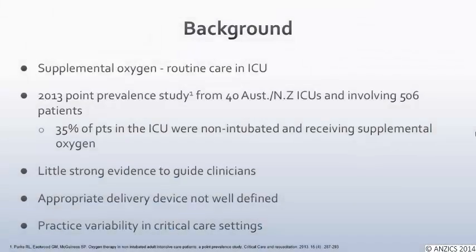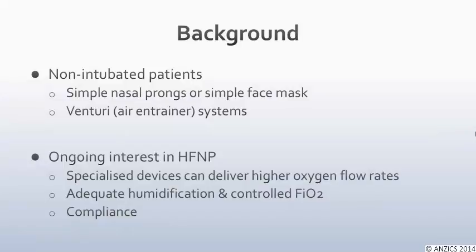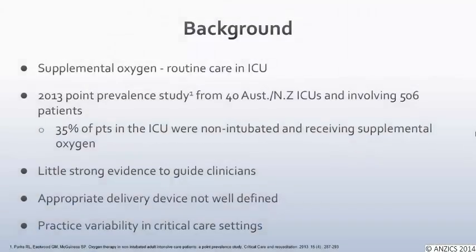It's fair to say that oxygen at the moment is very topical, and we can see from Glenn's earlier presentation that despite something that we consider routine care in the ICU, the management of oxygen therapy remains a matter of debate. On Thursday, here in this very audience, David Pilcher presented some ANZICS core data that demonstrated that despite more patients being admitted to ICU, less are mechanically ventilated. In fact, with the help of some recent data from Australia and New Zealand, we can quantify this further, with a third of our patients non-intubated and receiving some form of supplemental oxygen.